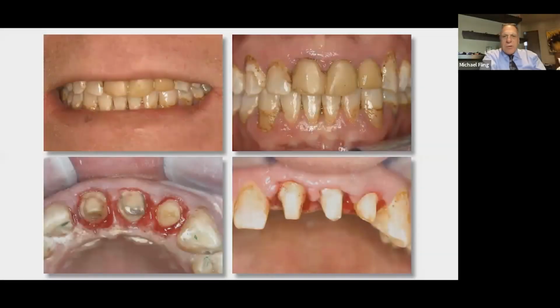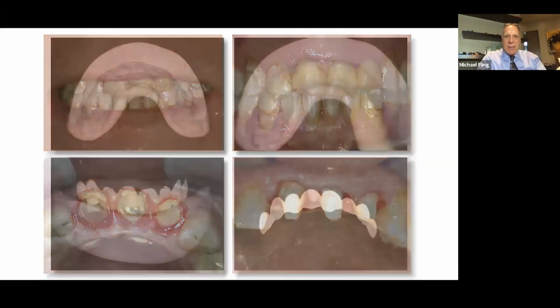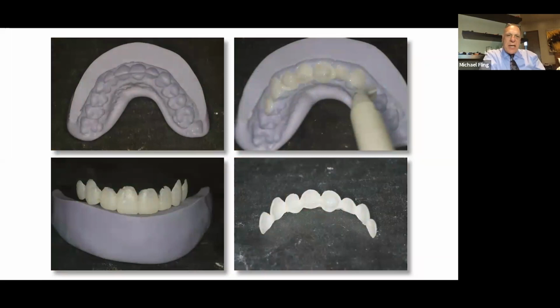This is a gentleman that presented to me, and he had a lot going on. As you can tell, his gingival tissues are not good. He had some old bonding, some composites, some things. We start to get all of this cleaned up. Notice the technique where I've done a wax up. We make a stent out of a Siltec material, and then we use various materials to create a shell.